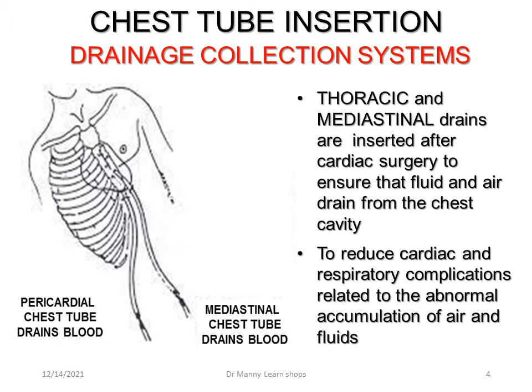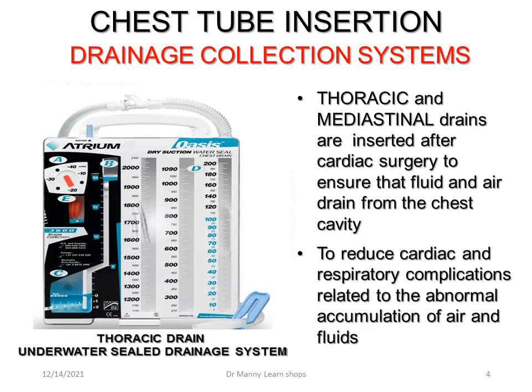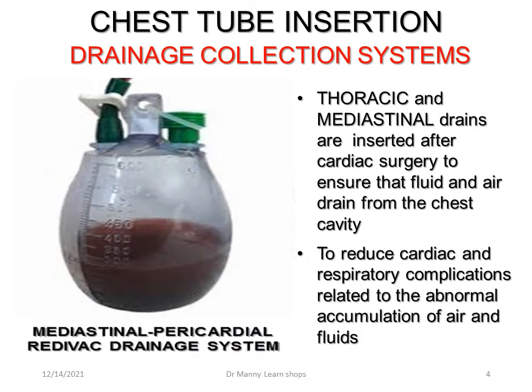Drainage collection systems. Thoracic drains are typically connected to underwater seal drainage systems, or they can be connected to RediVacs, which are typically mediastinal and pericardial, and these are controlled manually.